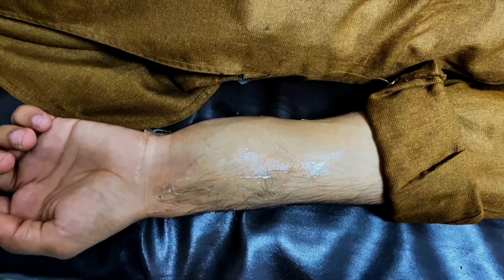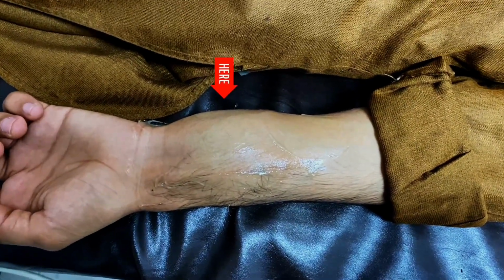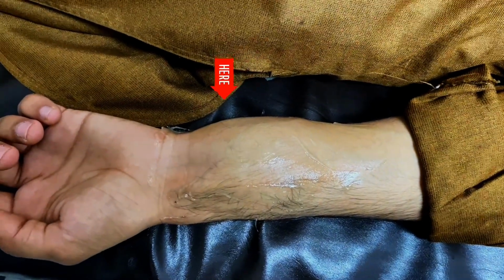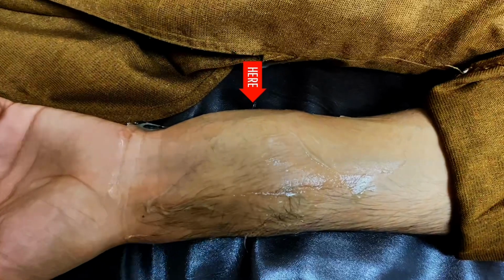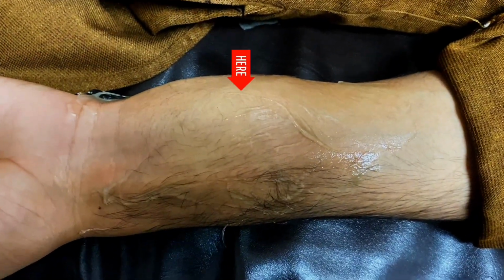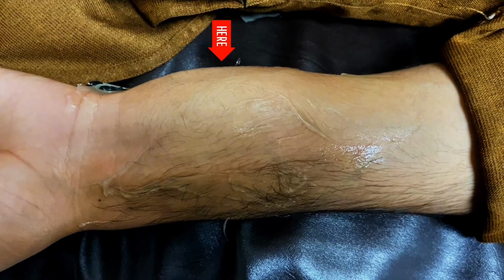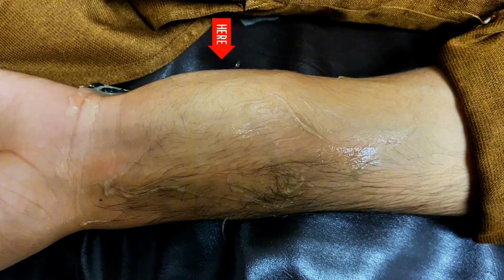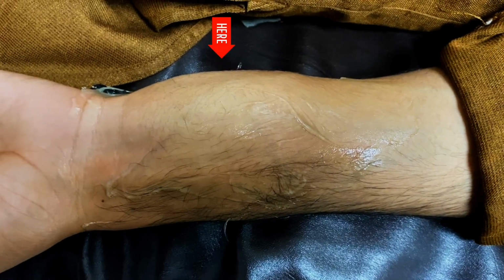A 20-year-old boy presents with complaints of swelling in the forearm. There is also a history of minimal swelling at this area, but it suddenly increased in size for 2 weeks and he is feeling severe pain.